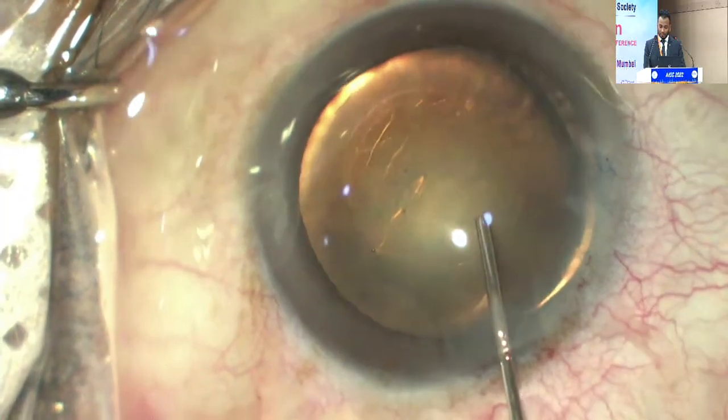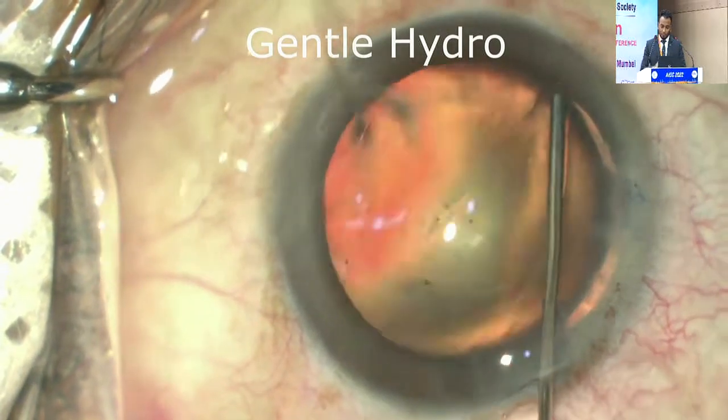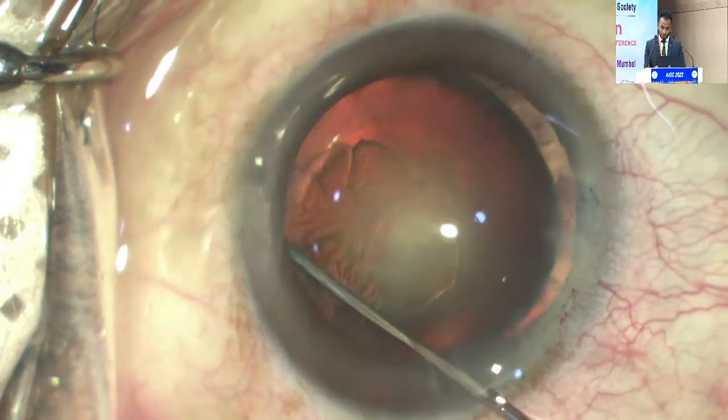This was a traumatic young patient, so it was fairly stable. A gentle hydrodissection procedure was done. You don't let the whole wave come to the opposite side or pop it out, just enough to release the corticocapsular adhesions.